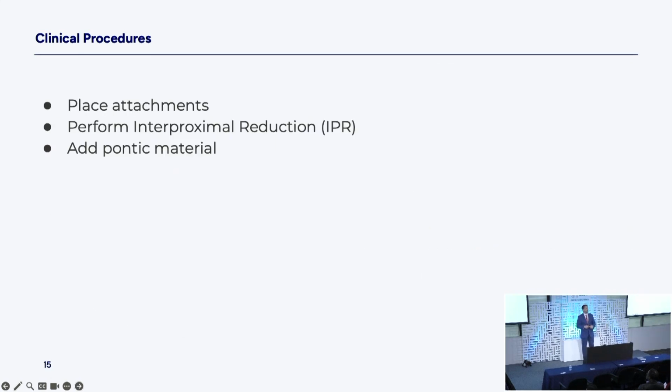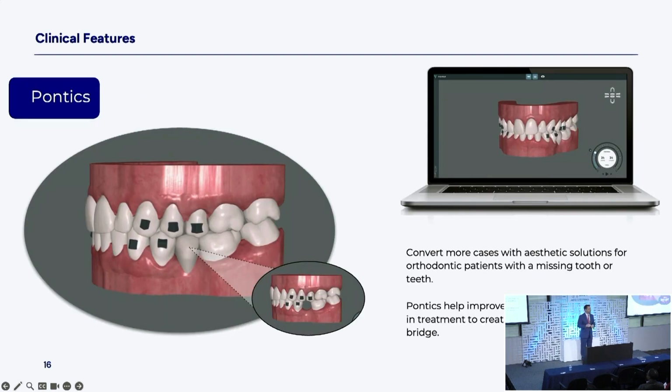Now, let's say you have a restorative case. The patient's missing a tooth or they fractured a molar's missing. You got a bridge you want to replace. You got to do a whole comprehensive care. Now, their aligners, we can add a Pontic to the aligner so it looks aesthetically appealing. Let's say they're missing a tooth somewhere. They want to smile. You add your Pontic.